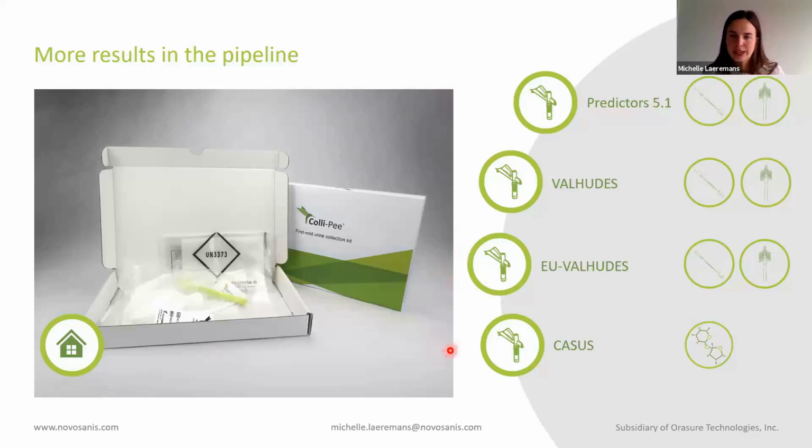In addition, the CASUS project uses a first void urine sample for the validation of a methylation-based triage test after the detection of a high-risk HPV infection. This allows a fully molecular approach towards HPV-based cervical cancer screening, where only one first void urine sample needs to be collected.